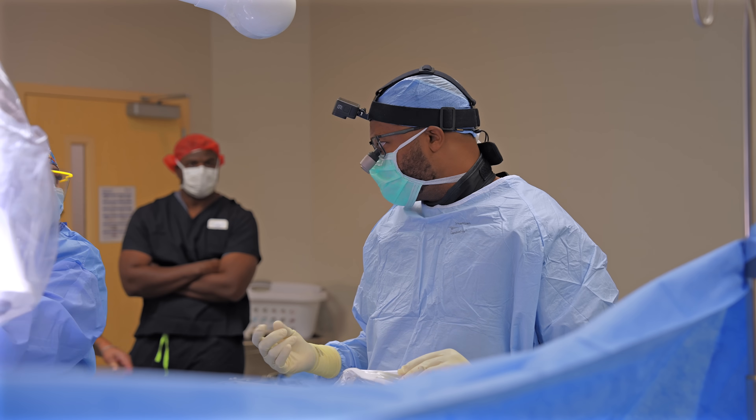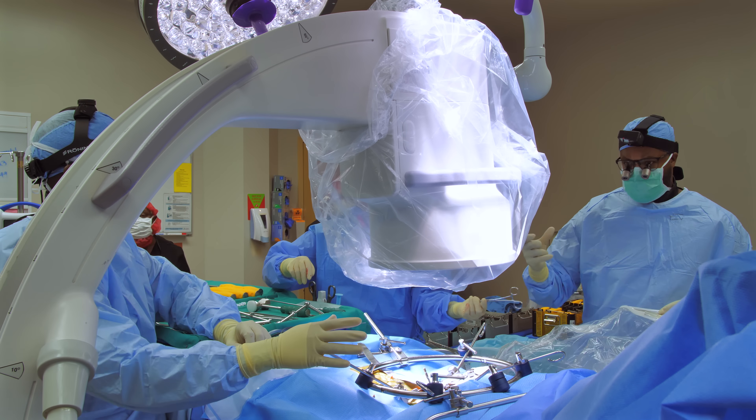I kind of like this. I can't go any taller than this. The medial-lateral fits fine.